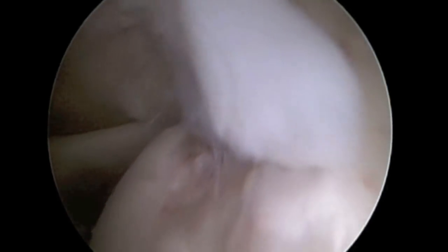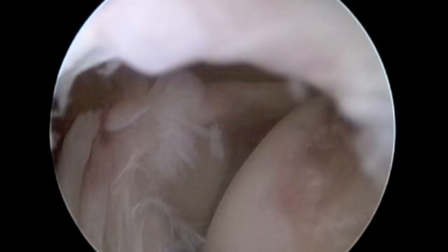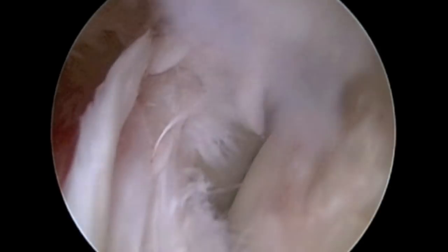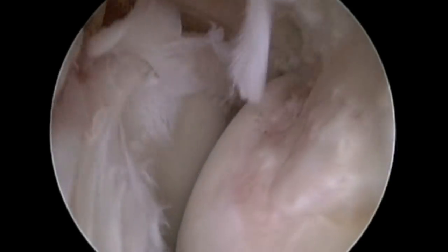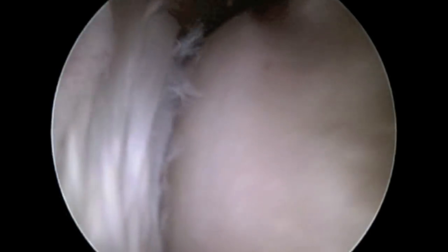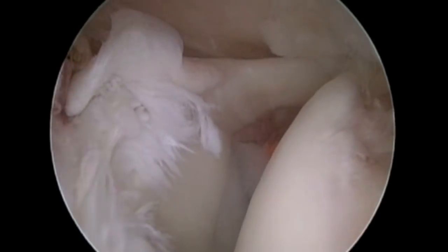As can be seen here, when the shoulder is taken into a cocking position, there's tension being placed on the undersurface of the rotator cuff which may lead to tearing, and the humeral head or ball portion of the ball and socket joint rubs up or impinges along the glenoid and the labrum on the top and back portions of the socket.